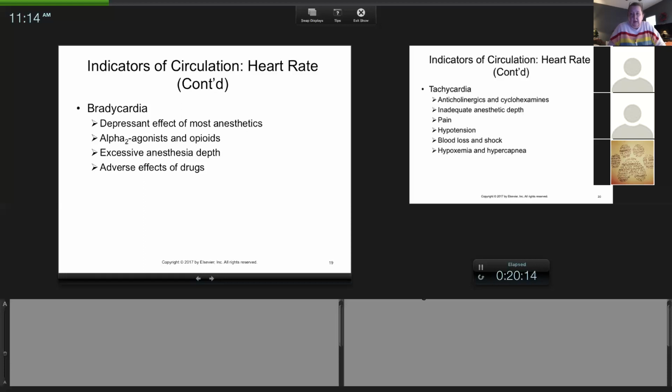Dr. Ritz started doing the neuter, popping out the testicle and doing her clamping. All of a sudden, the heart rate went 70, 60, 50, 44. And just like that, I said, turn him off right now, or put him on 0.5%. We turned his anesthetic down.